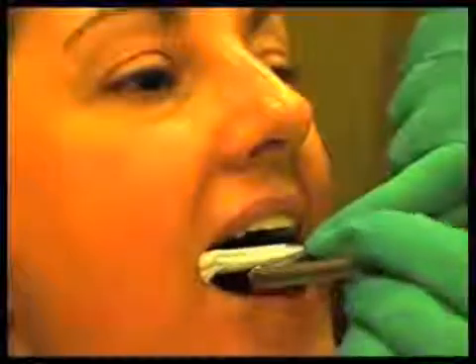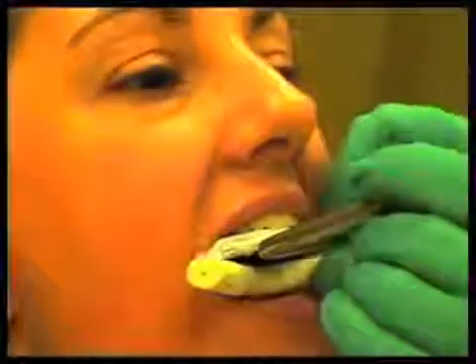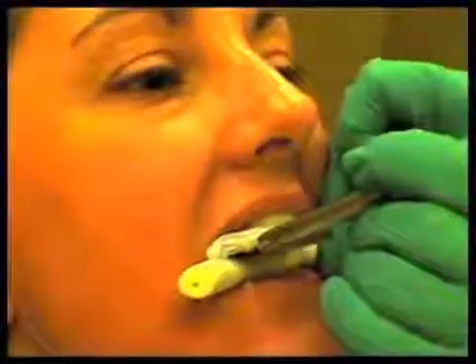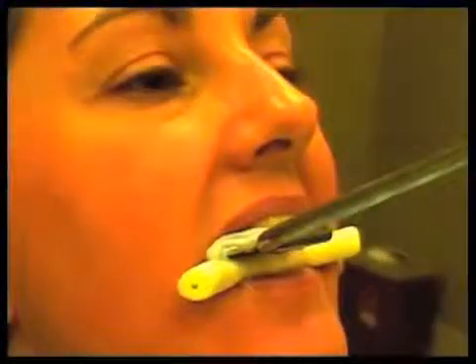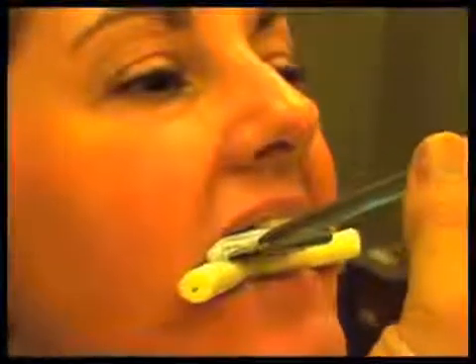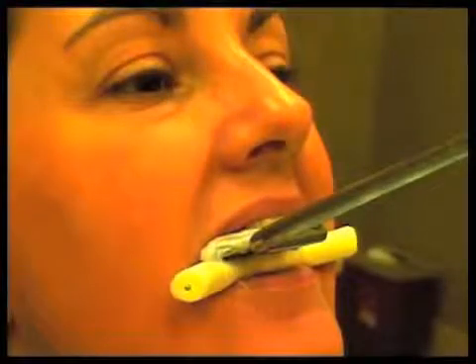All right. And what we're going to do is that little line on the Facebow is always going to be up. And we're going to go ahead and just seat it against her teeth and use a light bite fork or a large cotton roll to stabilize it. And what I like about this is notice now this thing is pretty much on there. Once that gets nice and hard, there's only one place that fits.